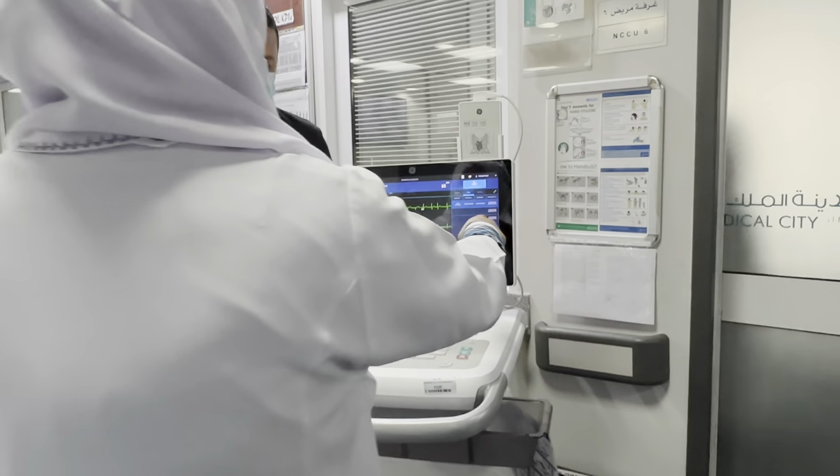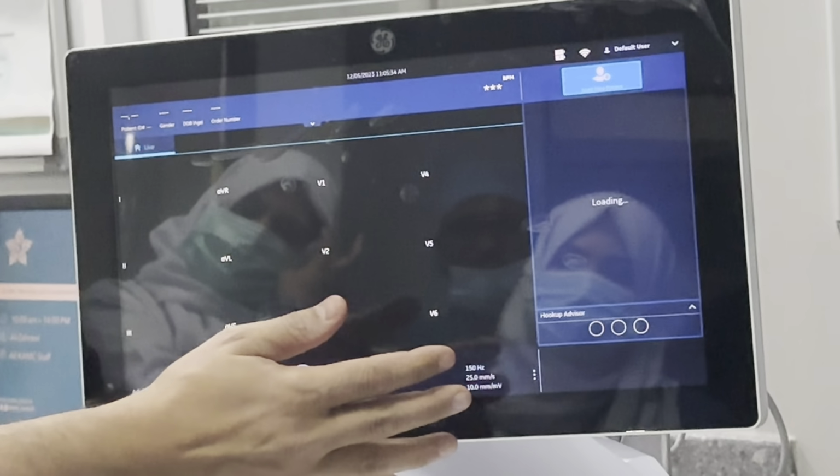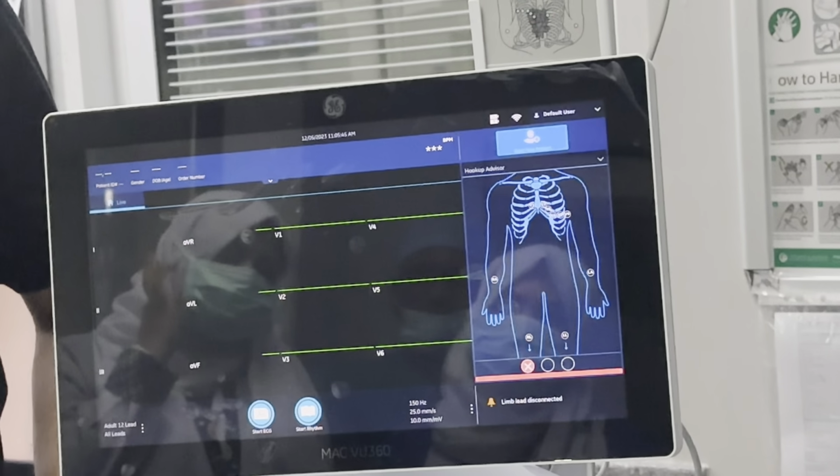You said no, we cannot send it, it is not sent. How can we send it? You also said to start the ECG, do the ECG for your patient. This patient, as I said, these are mandatory fields. It will not stop you acquiring an ECG. It will stop you transmitting that ECG.